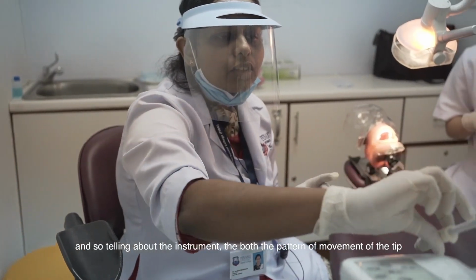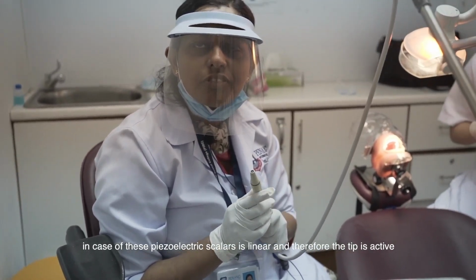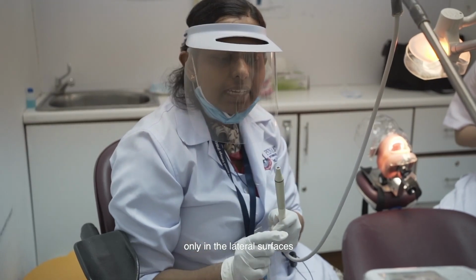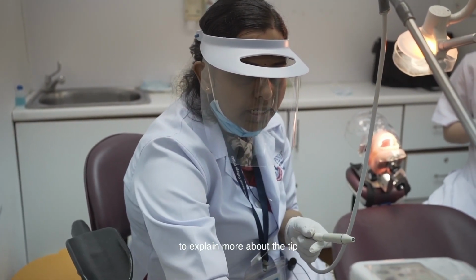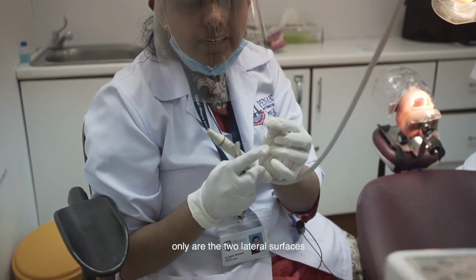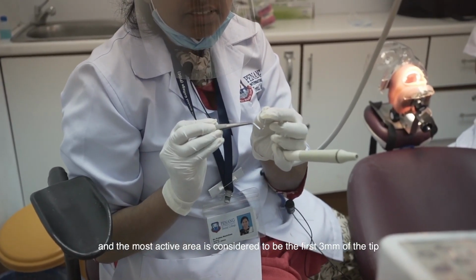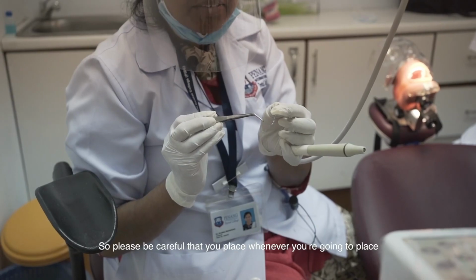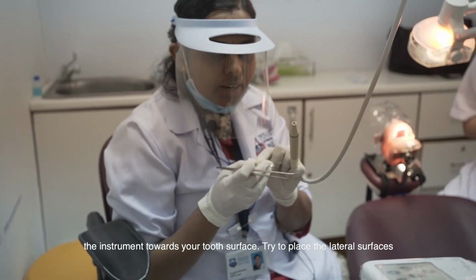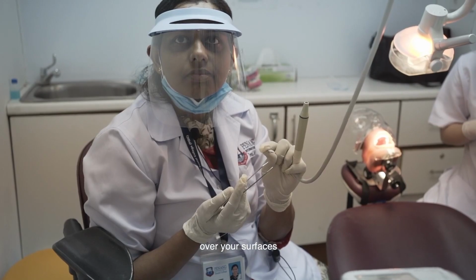The pattern of movement of the tip in piezoelectric scalers is linear, and therefore the tip is active only on the 2 lateral surfaces, and the most active area is the first 3 mm of the tip. So please be careful, whenever you place the instrument towards your tooth surface, to place the lateral surfaces over your tooth surface.